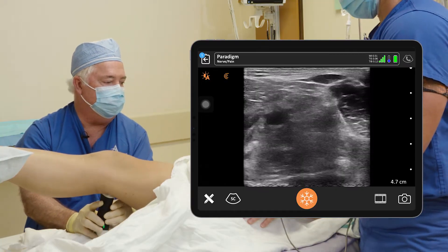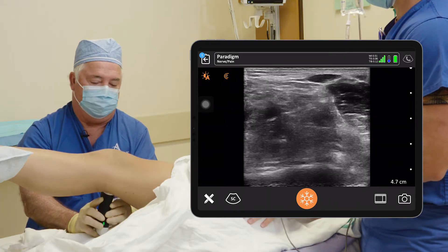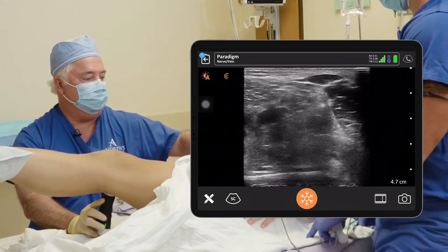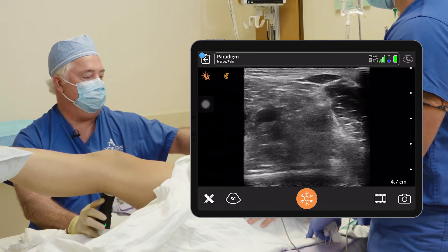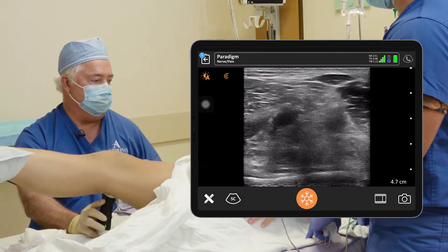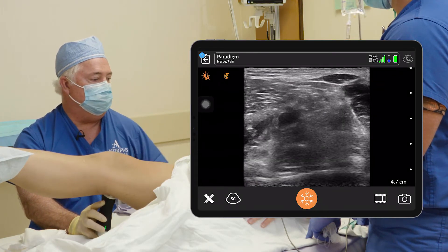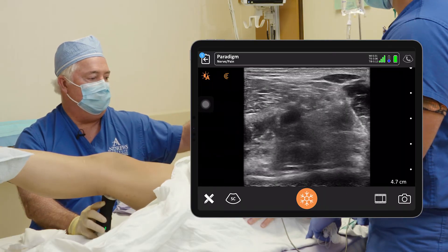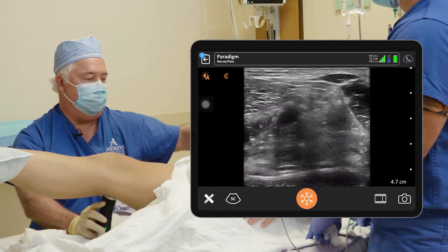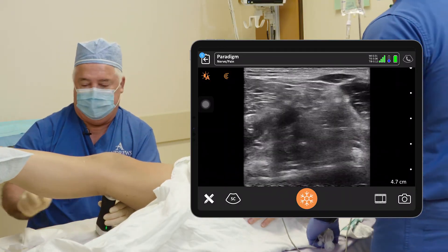So normally I try to get a little bit closer to the femur, but my entry point kept me from doing that. We got a nice infiltration between the posterior capsule of the knee, the posterior femur, and the popliteal artery that's beating right in the middle of the screen. The nerves — the tibial and peroneal nerves — are going to be superficial, so above the artery, well out of the way of our infiltration down near the posterior capsule of the knee.